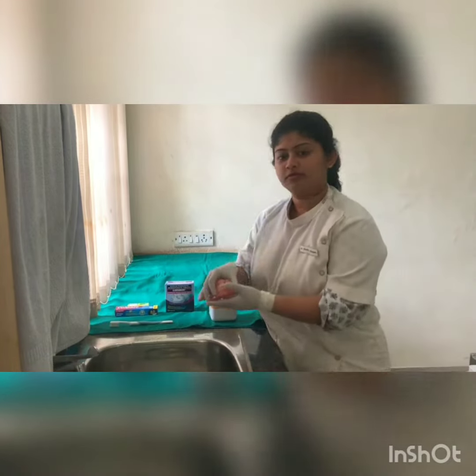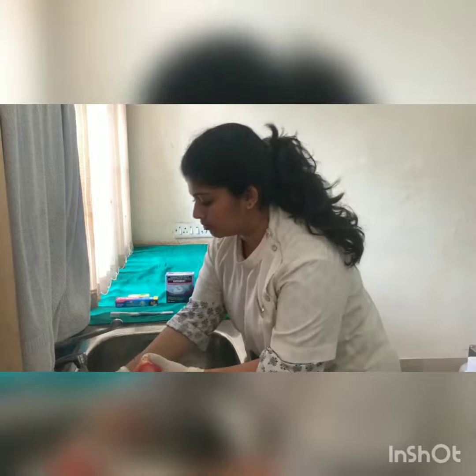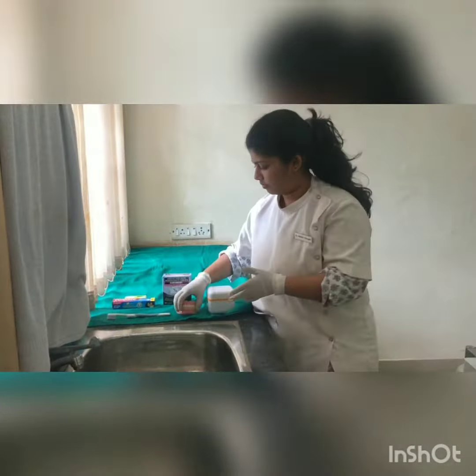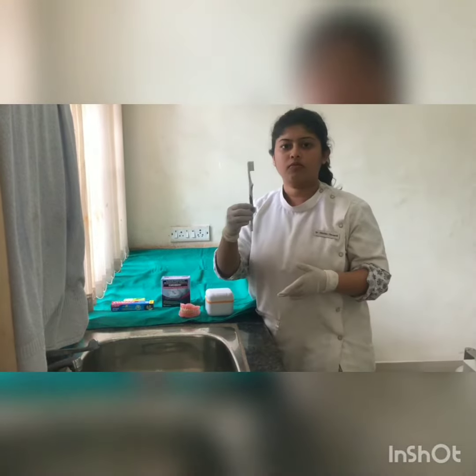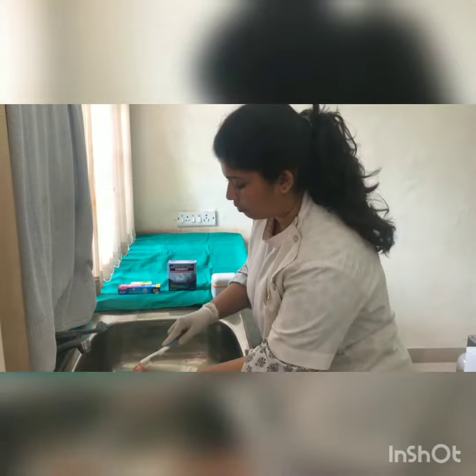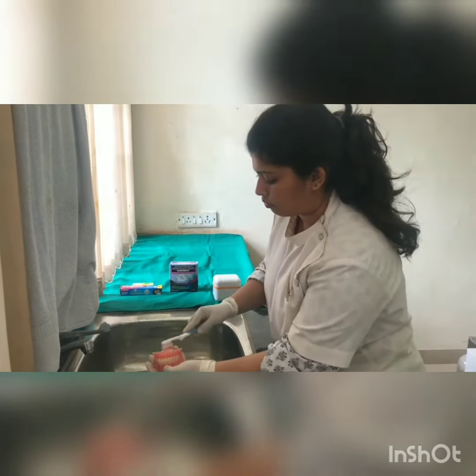Rinse your dentures and mouth after every meal. Clean your dentures with a soft brush specially made for dentures. Preferably clean them in a wash basin, as dropping the denture might lead to its breakage.